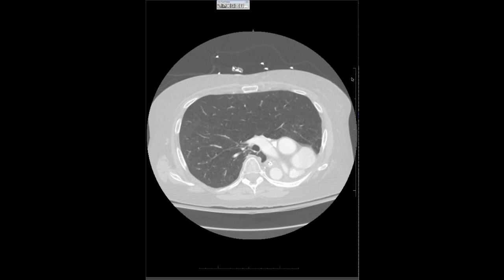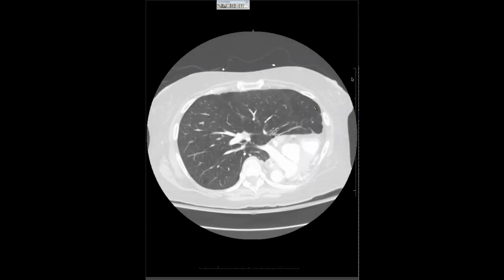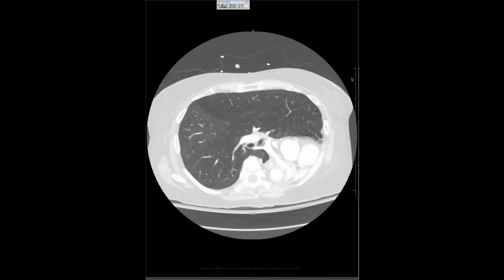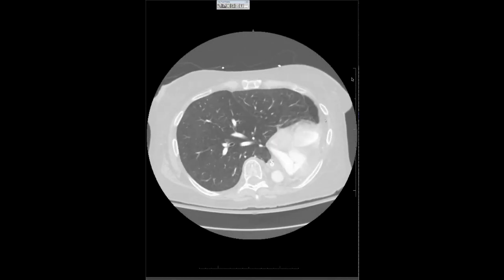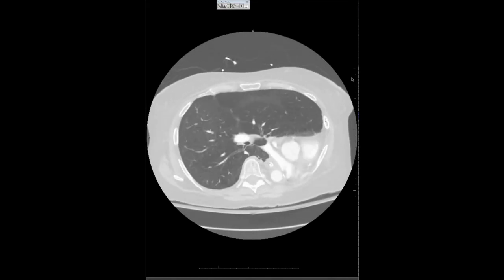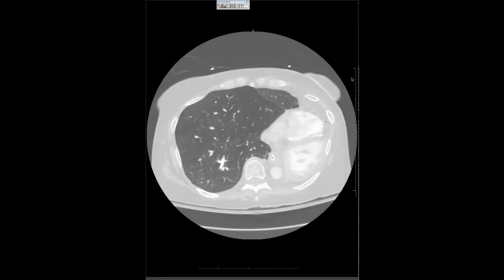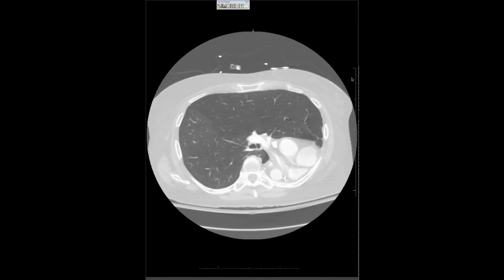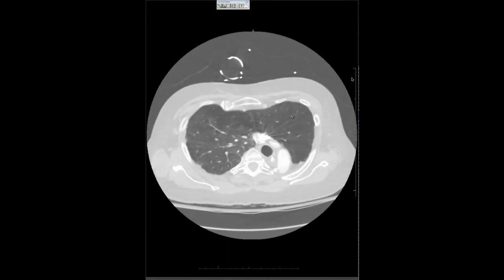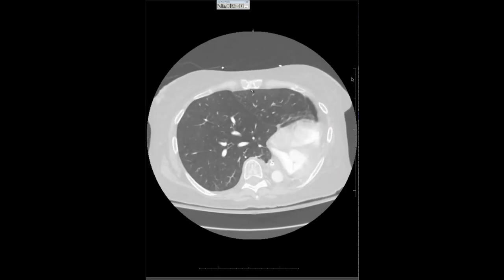This is not herniation, because herniation means that there's a barrier that has been breached, so a hole in a barrier. In this case, the anterior junction line is the barrier between the two lungs, and the anterior junction line is just rotated off into the left hemithorax because there's no left lung anymore. So the heart is rotated, it's dragged the anterior junction line with it. There's no barrier that's been breached. The barrier has moved. It's moved way over to the left armpit, and the right lung has been dragged across. So this is not a hernia. There's no barrier that has been compromised.